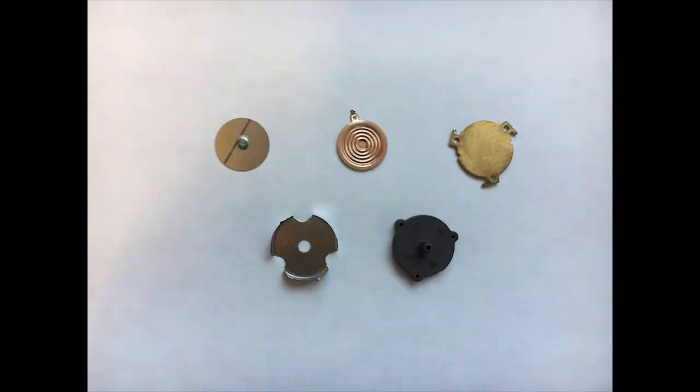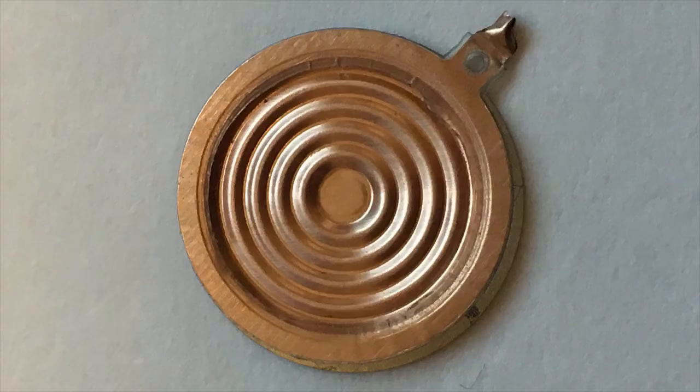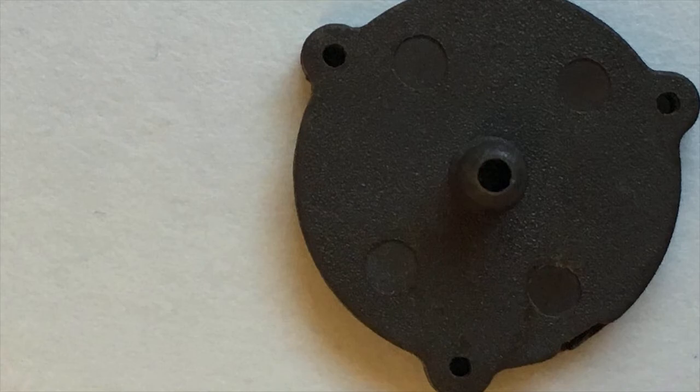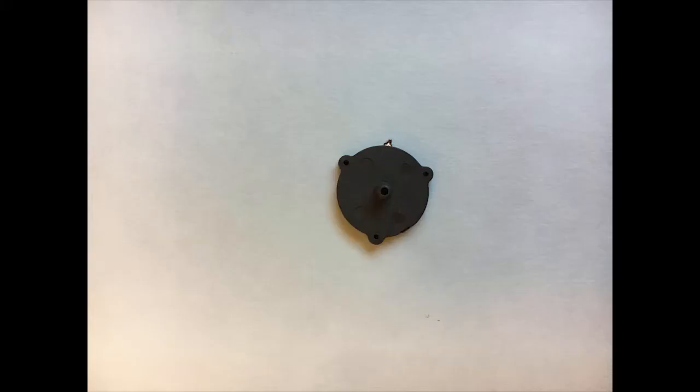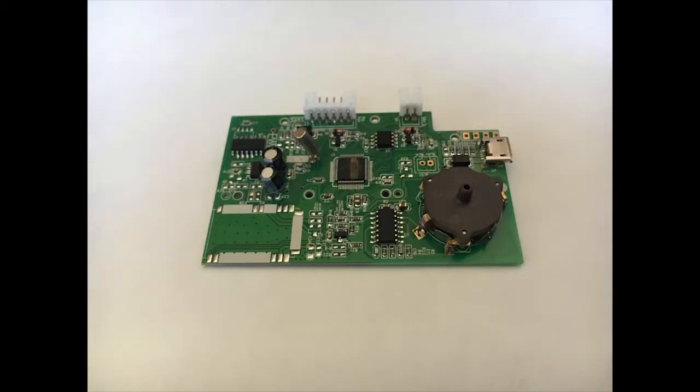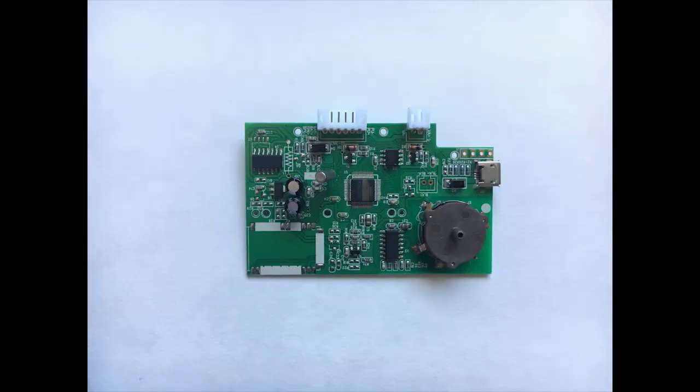Taking a closer look at the capacitive pressure sensor, it has five components: a silver metal plate, a copper plate, a brass-like plate, a silver metal encasing, and a brown plastic piece. The flat silver metal disc was soldered to the copper diaphragm, and together they were fitted inside the brown molding piece. As air flowed through the nozzle on the backside of the brown piece, it moved the copper diaphragm back and forth, changing the distance of the silver metal disc to the brass plate, which generated the capacitance that the monitor relies on to take your blood pressure.